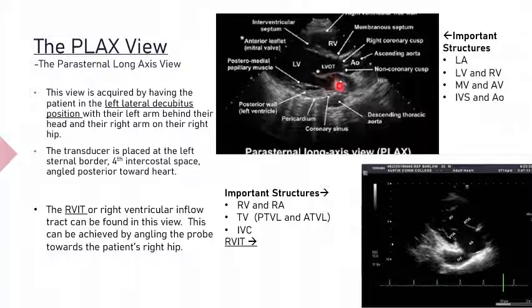And this is the PLAX, and here's the left atrium, and mitral valve will be here. It's not labeled. That's important. Left ventricle, the outflow tract for the left ventricle, and then you would have the aortic valve and the aorta, and you even see the right ventricle here.